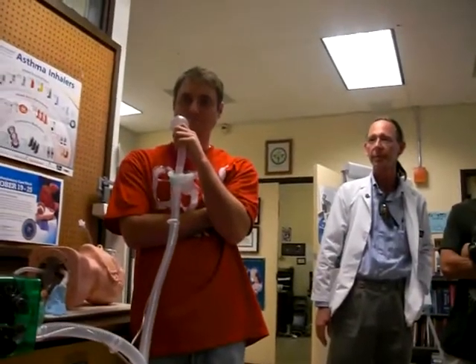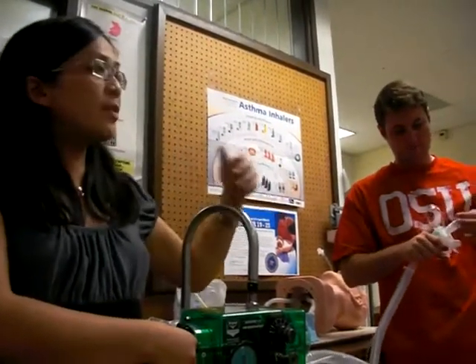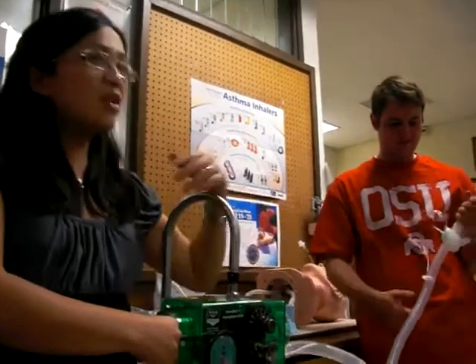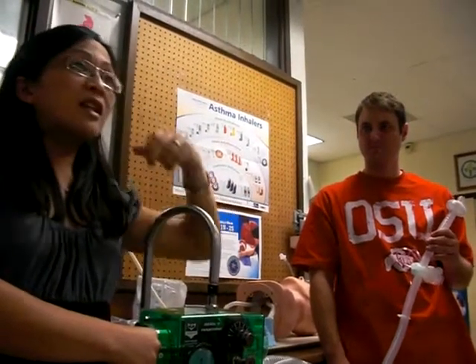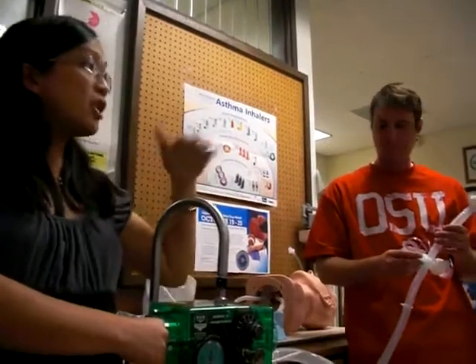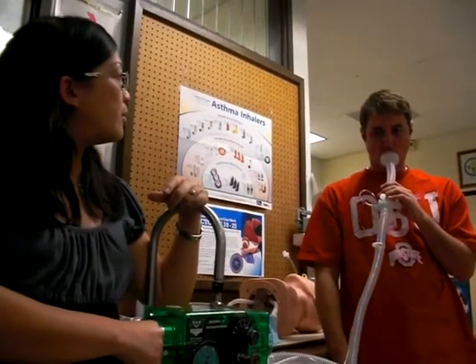You need to be a little bit more specific — because acapella is also a breathing treatment. Say: 'I'm here to give you a breathing treatment to help inflate your lungs.' Have you ever done this before? What's going to happen is you're going to put this in your mouth. When you take a deep breath, the machine is going to push air into your lungs. It's very important to keep a good seal and try to relax — don't fight it. Let the machine fill your lungs with air.